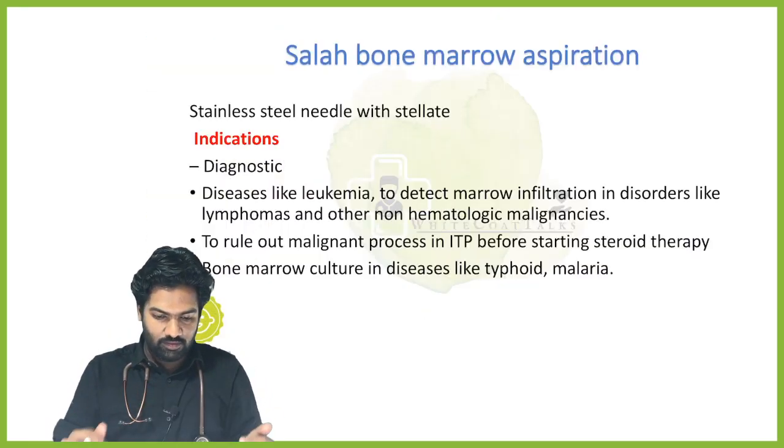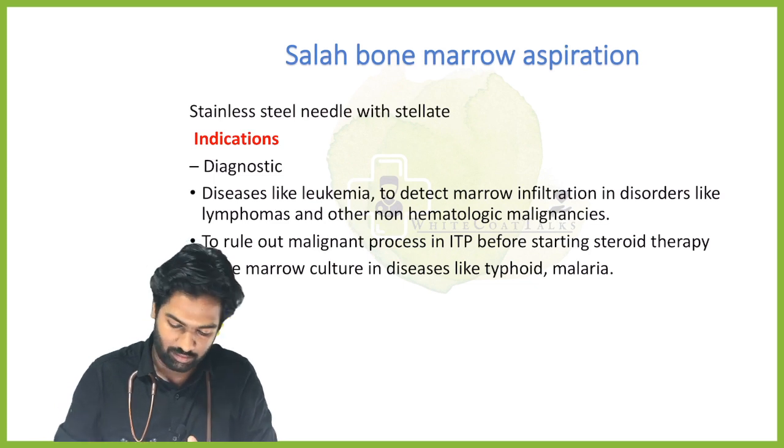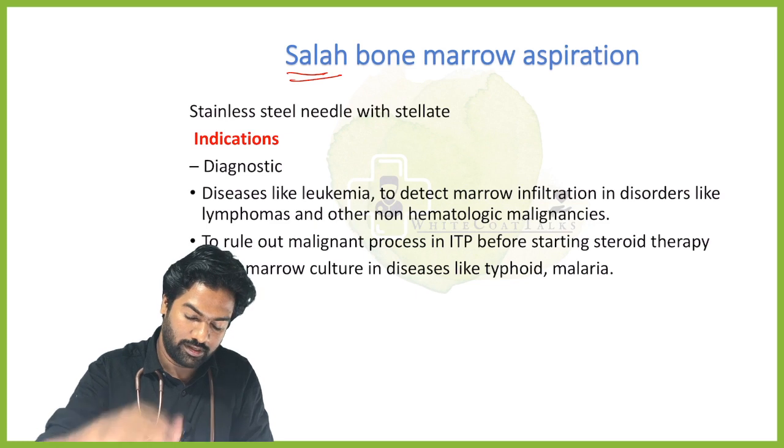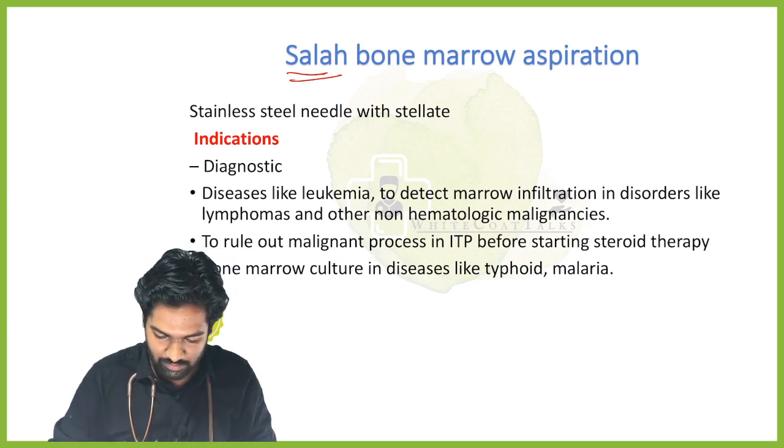Fine. Next, I have written here Salah's bone marrow aspiration needle. Most of you will get confused with it, so first we'll see the needle and identify it. I'll try to label the parts then and there, and then directly we'll go to indications. You can write down these indications, and I want you to remember at least 3 of them.